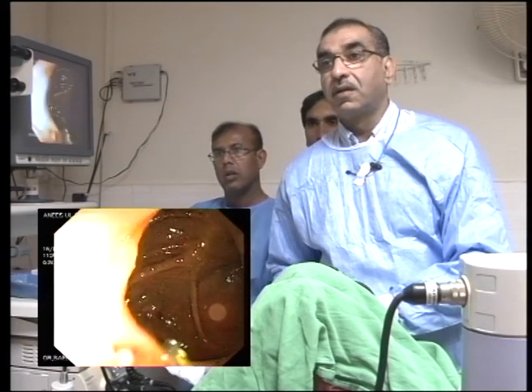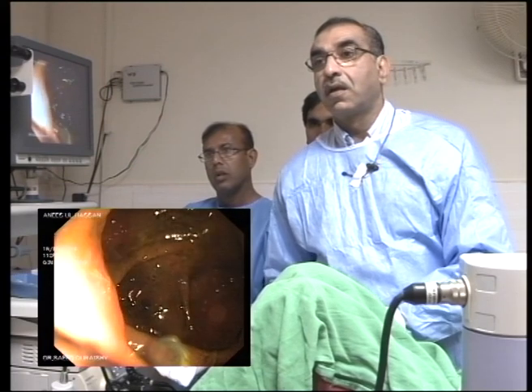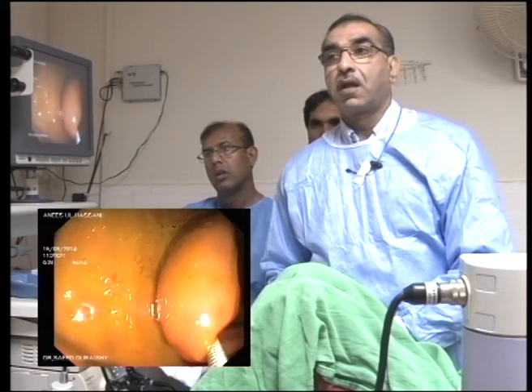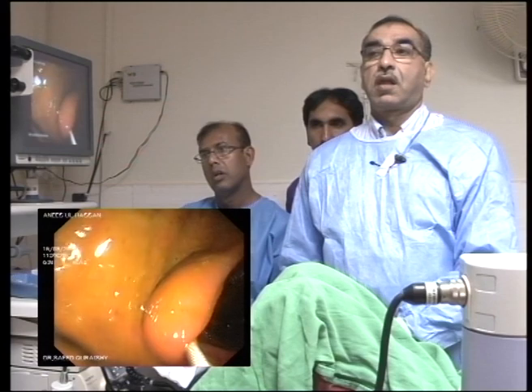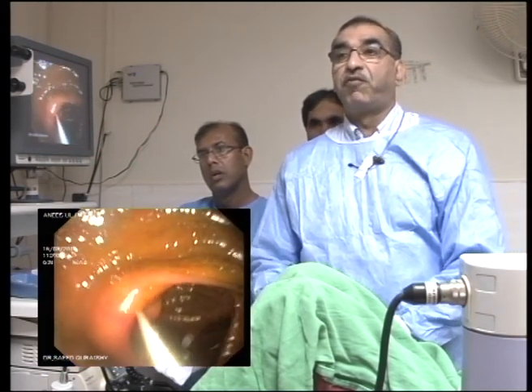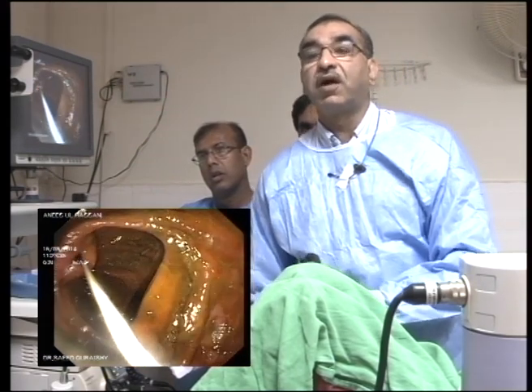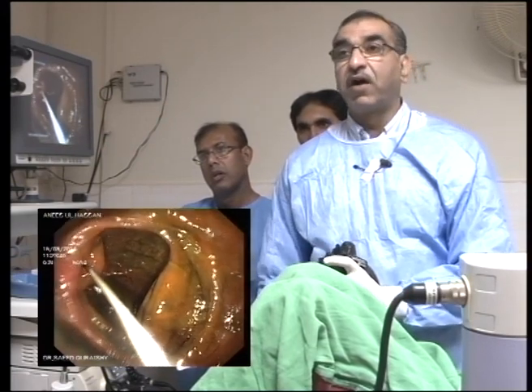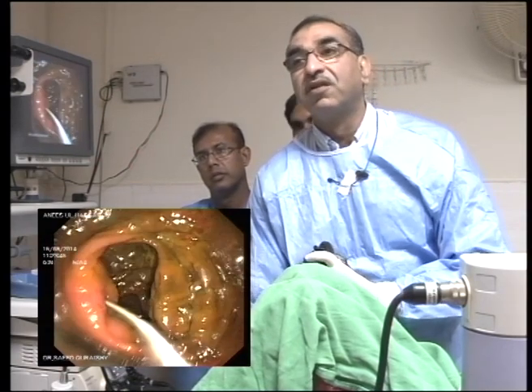There it is. The forceps is there, so you can follow it up with your scope. We can see it clearly, the forceps down, and we can see the ileocecal valve there. So you can use that as a guide wire, but in this type of situation, it's quite uncomfortable for the patient. So I would rather not.